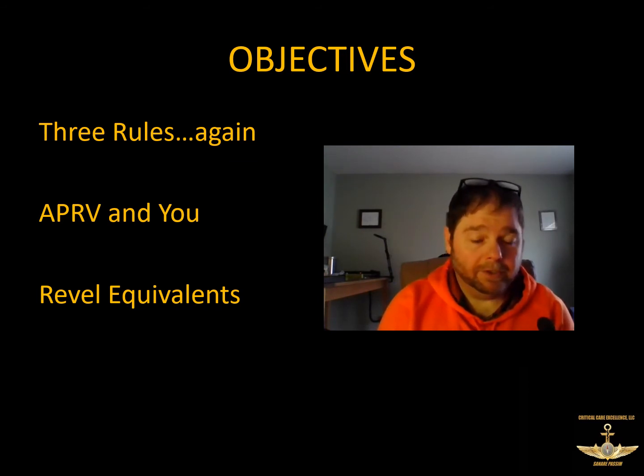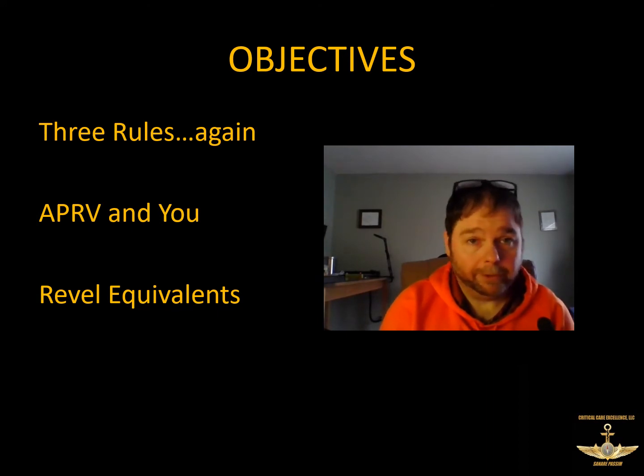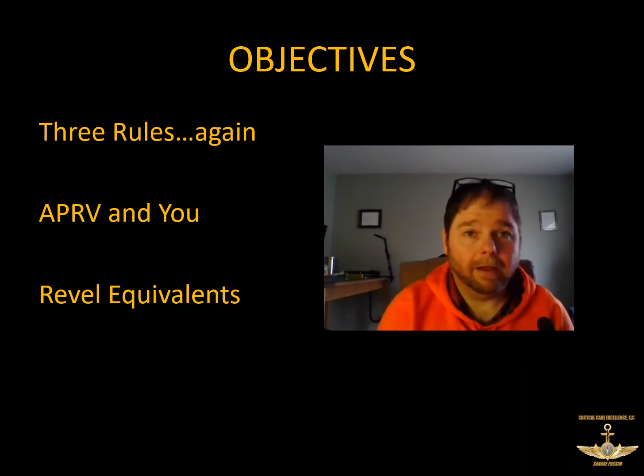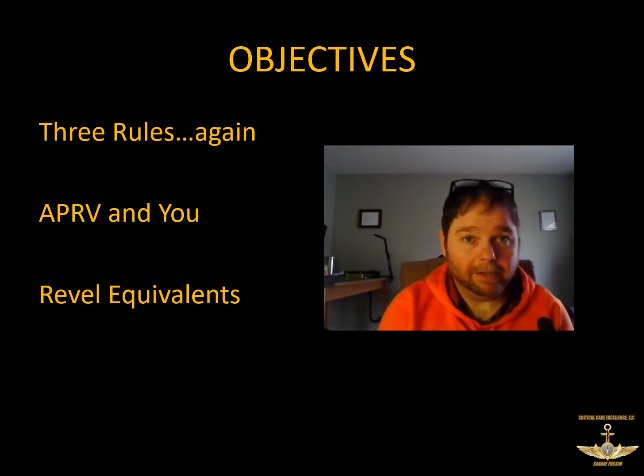And that will get us into the things our ventilator will and will not do. It'll do most things. And looking at our Revel mode conversion chart for the ways that we can make our ventilator either exactly mimic the hospital's ventilator, or the way we can make it simulate and get pretty close to what the hospital ventilator is doing, to make sure we can give that patient what they need and the amount of support they're going to have for the duration of our transport.